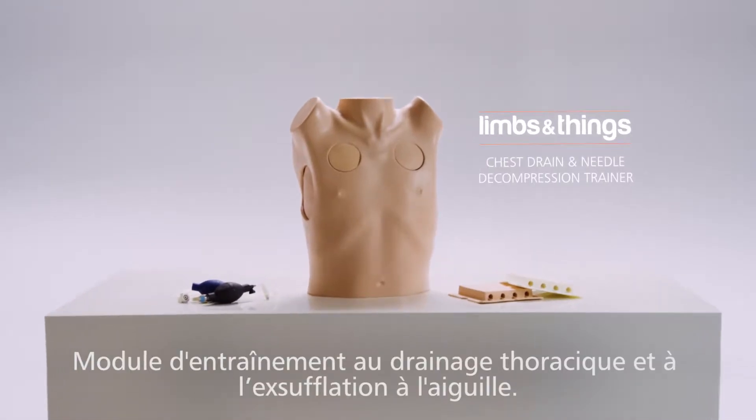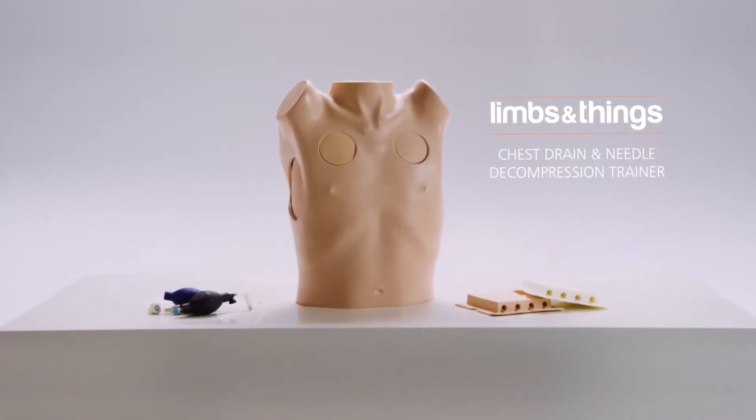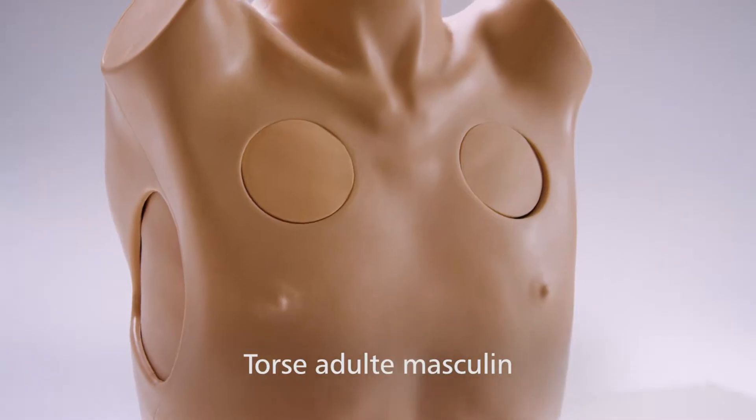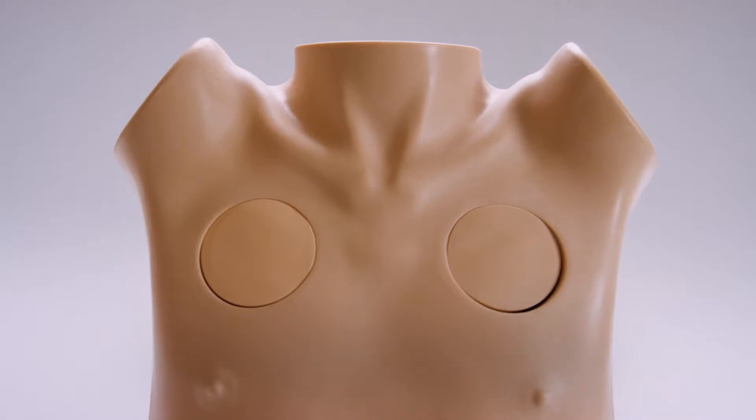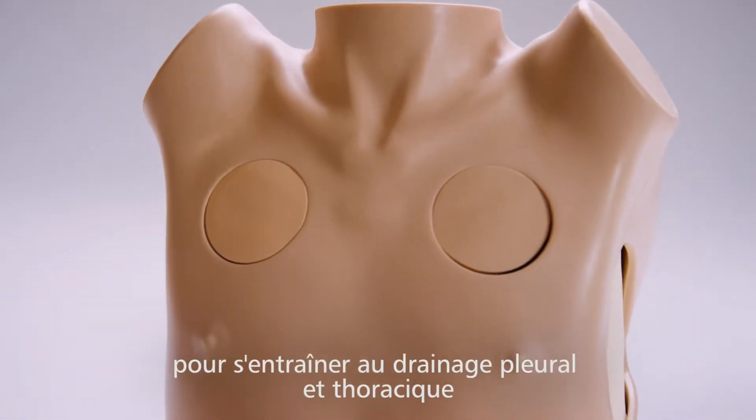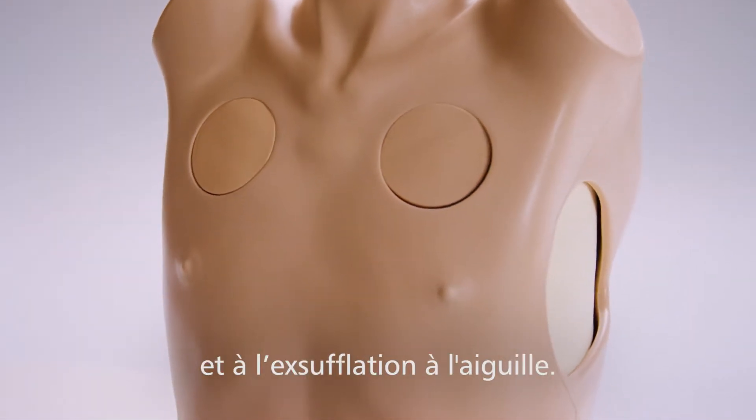This is the chest drain and needle decompression trainer from Limbs and Things. It is an anatomically accurate representation of an adult male torso, providing a complete training tool for chest tube insertion, chest drain, and needle decompression.